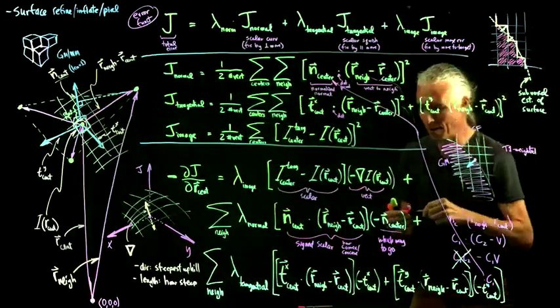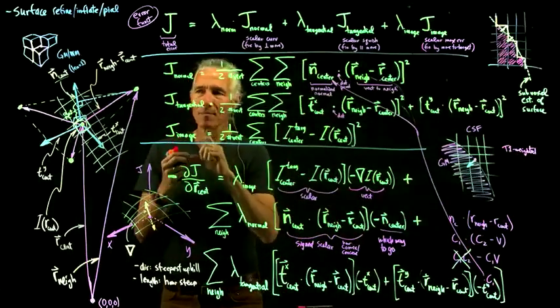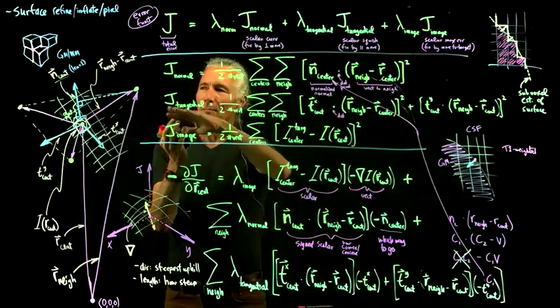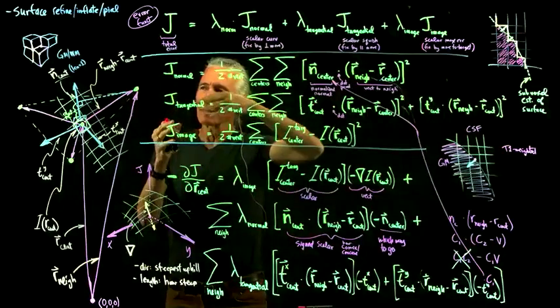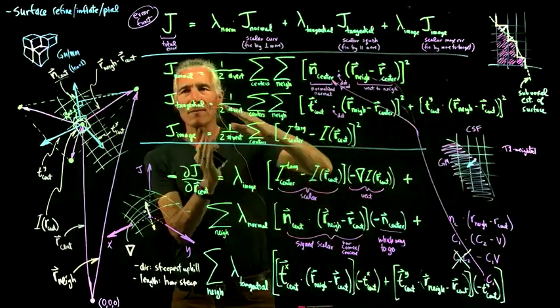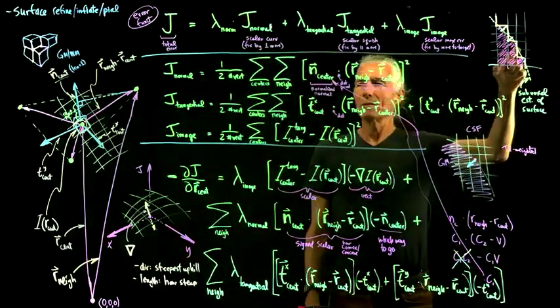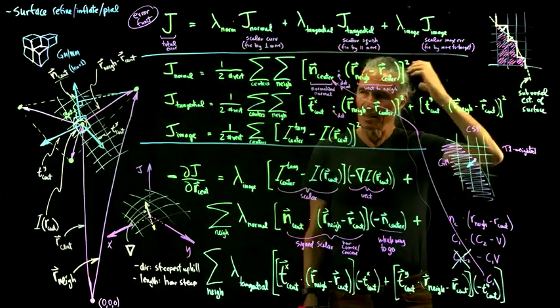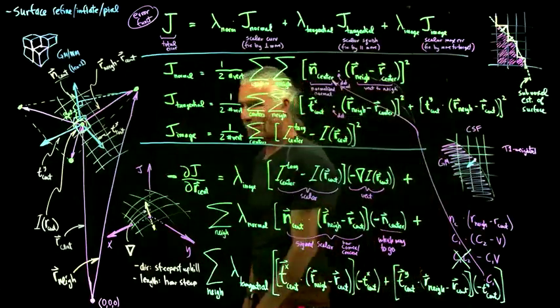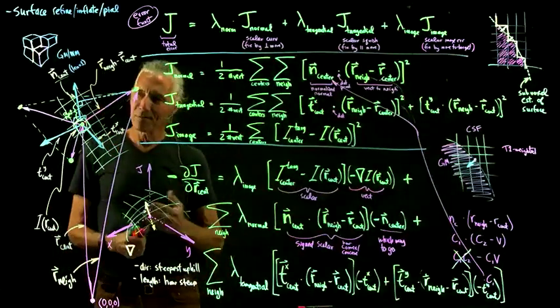And it can be so accurate that you can do something like calculate the cortical thickness, which is just a couple voxels thick. So it's a couple voxels, meaning if you just classified the voxels, you'd end up with very jaggy surfaces. But if you refine them, then you can actually calculate these subvoxel differences in cortical thickness. And so that's how FreeSurfer works, how part of FreeSurfer works.